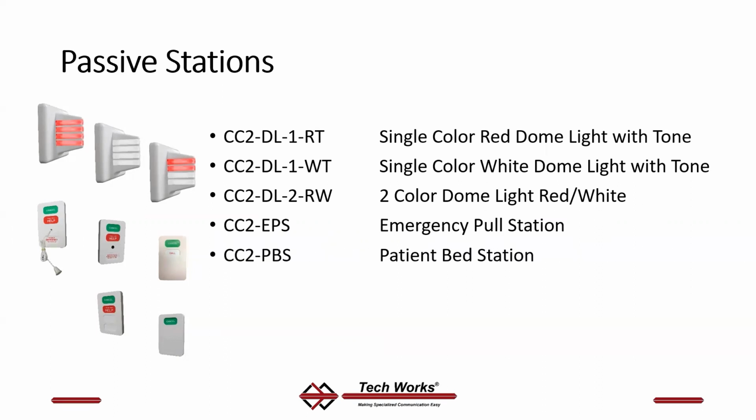The same thing with the bed station. There are reasons why, for patient convenience, they might want a call cord and a bed station somewhere. And I'll give you an example. Chemotherapy. It may not be a code requirement that a chemotherapy patient have a call button. Some places it is. So you've got to be aware of this.